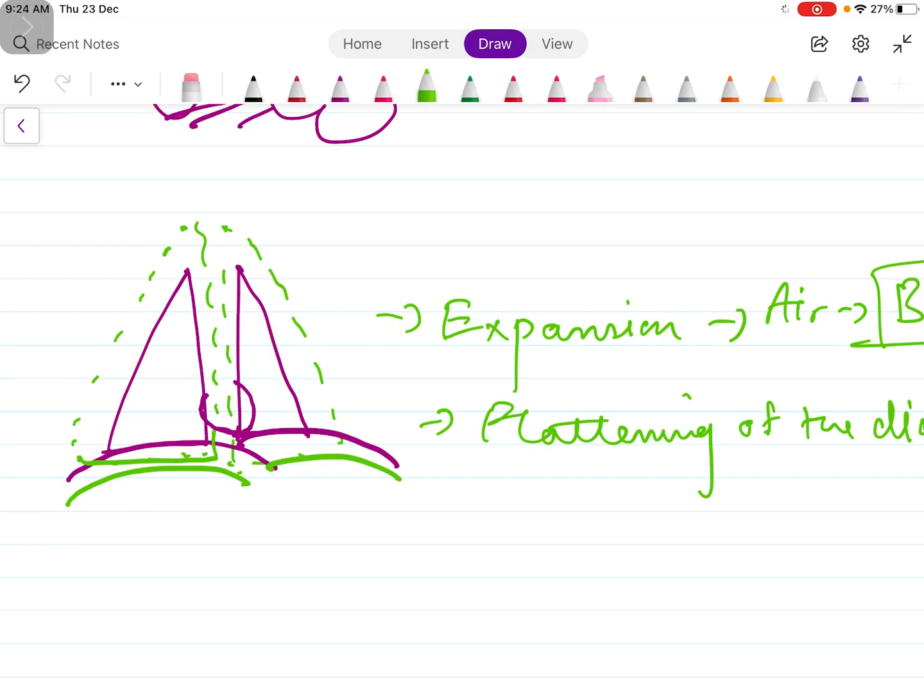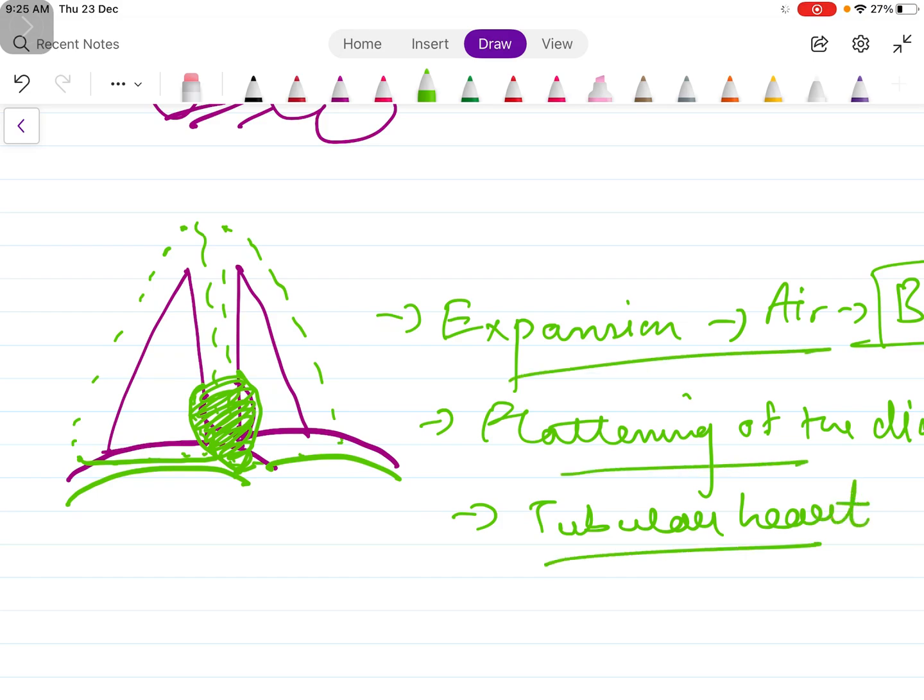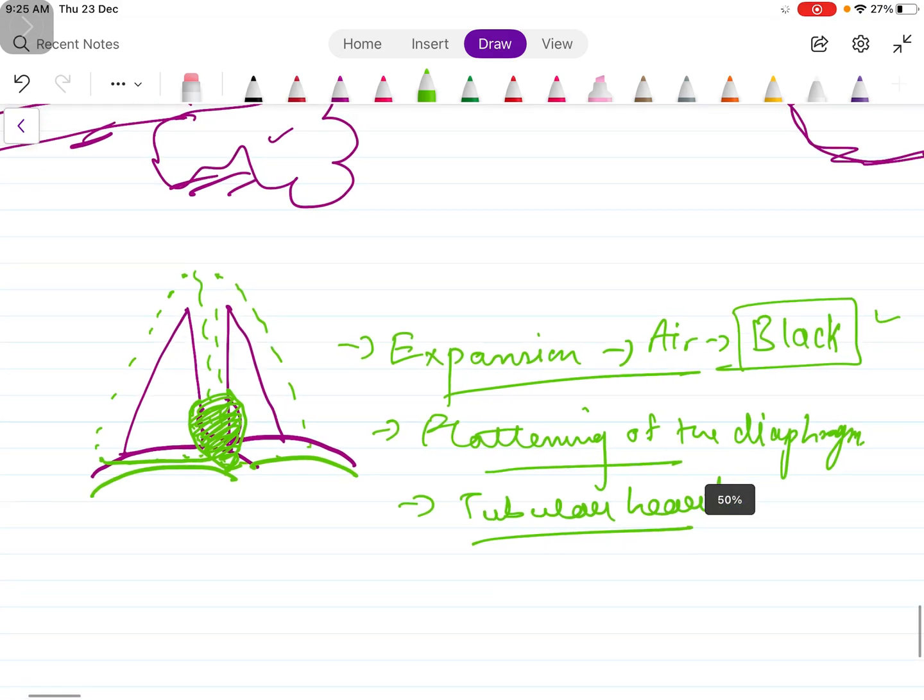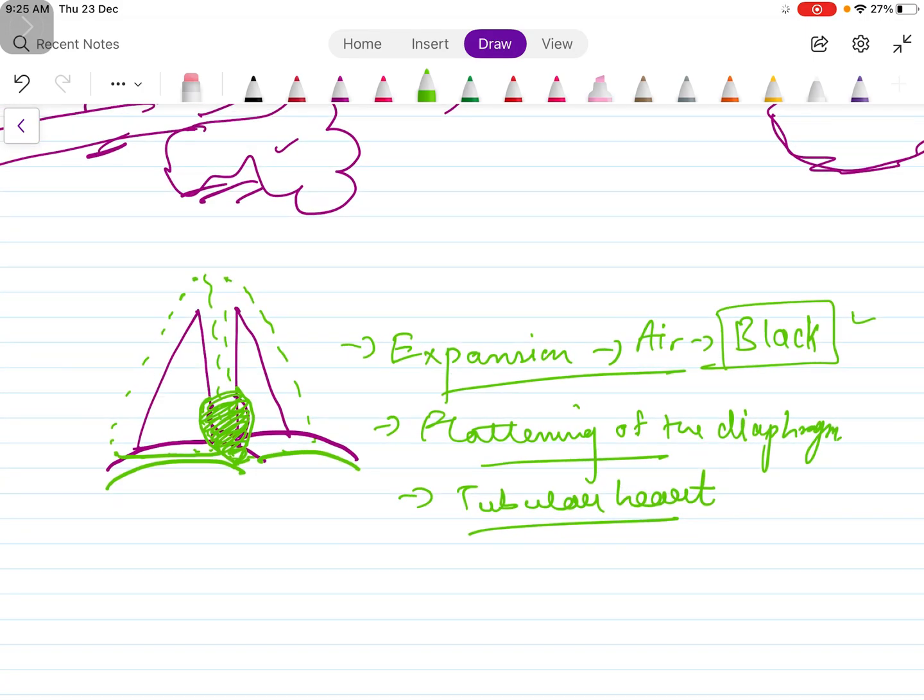Now what happens is there is a heart here which looks like this in normal x-ray, but because of the pulling of the diaphragm, as the heart is connected with the diaphragm, it will also be pushed downwards and it will appear as a tubular heart.